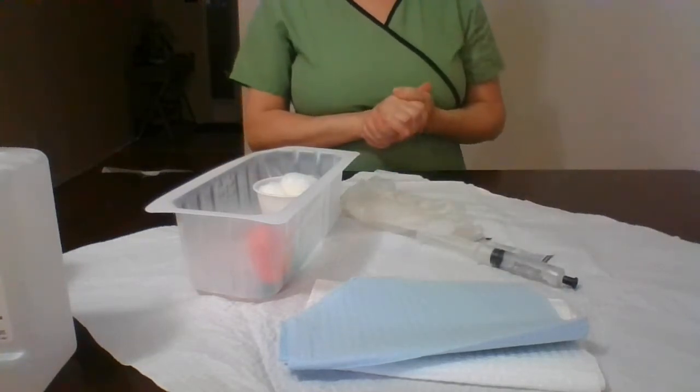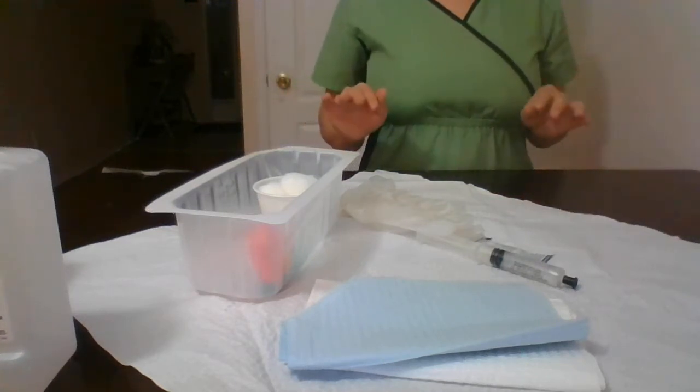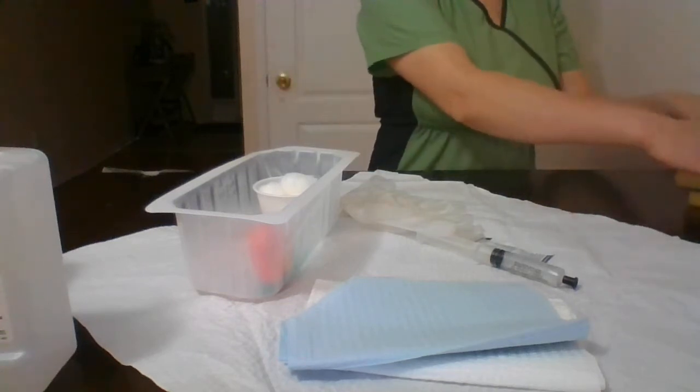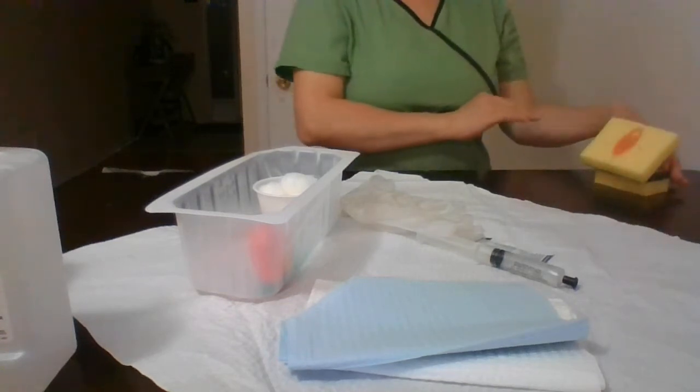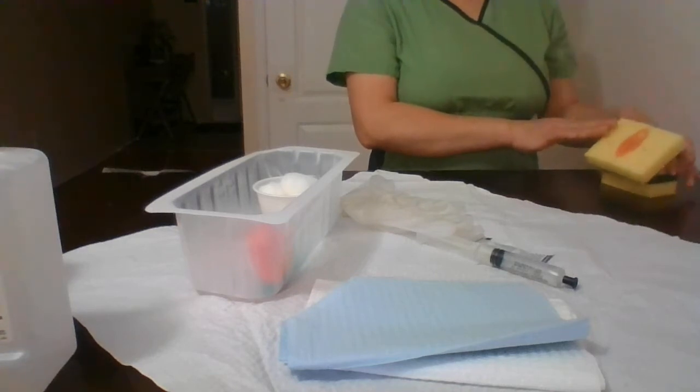Okay, so before I put on my sterile gloves, I will make sure that my patient is placed in the position that she's supposed to be in before we insert the catheter. The position that I will place my patient in is dorsal recumbent.